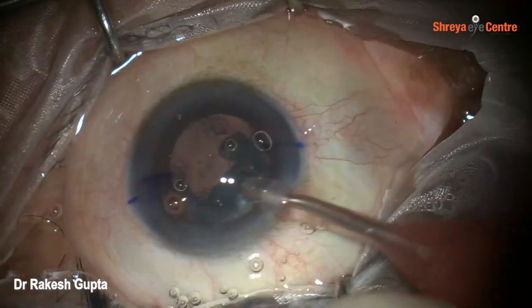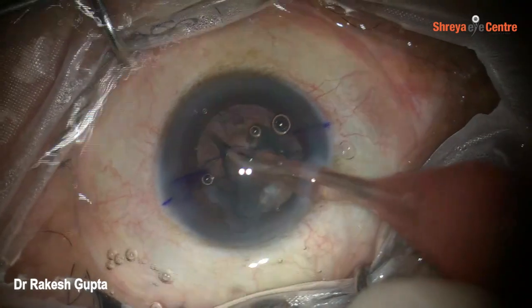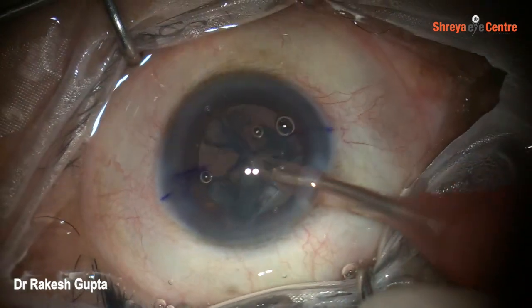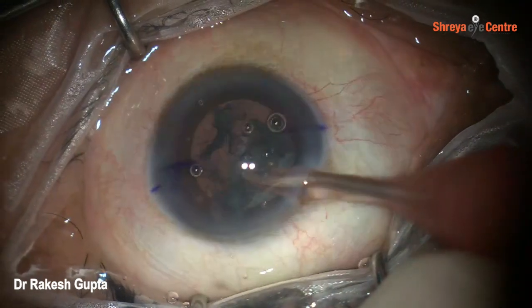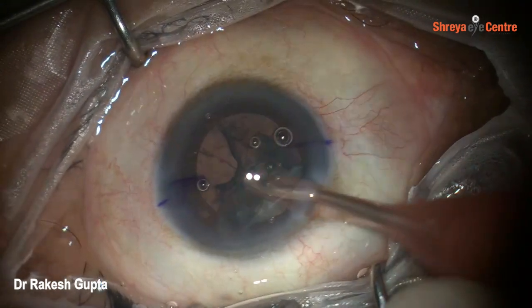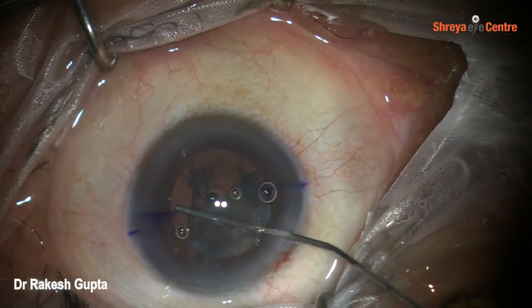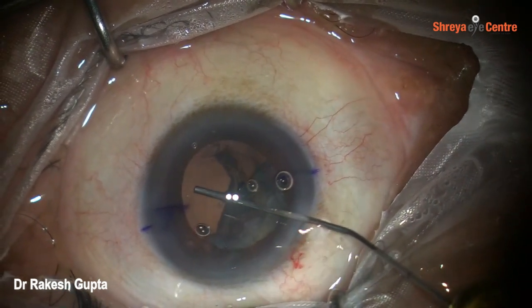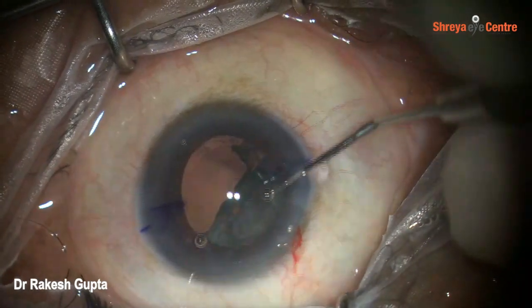And now I am removing the cortical plate with the phaco tip itself. Friends, it looks risky, but because I have injected Viscoat over the posterior capsule and over the capsular rent, it actually gives very good support and it doesn't lead to extension of the posterior capsule rent, as well as it makes our job easy. Injecting some more Viscoat over the posterior capsule to push the PC backward.